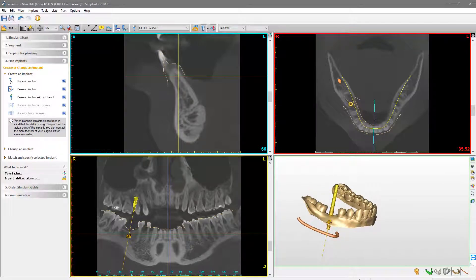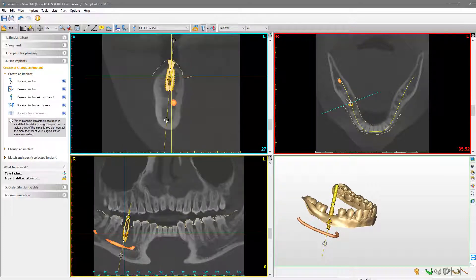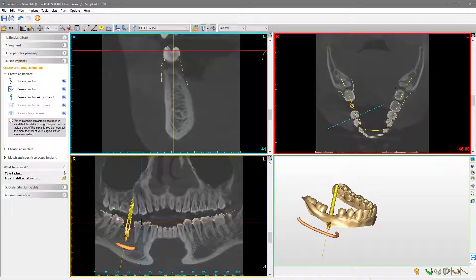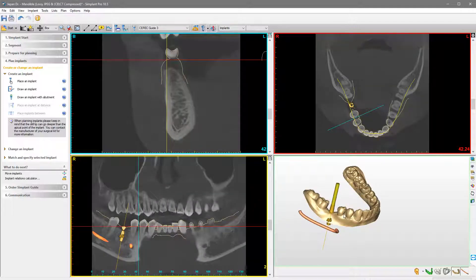In order to navigate through the images, you have several options. Just left-click on any point of the anatomy, and Simplant Pro will show the images that cross that point. You can also do this in any other of the 2D views, or even in the 3D view. This is very helpful to drive your focus to the areas of interest in the patient's anatomy.